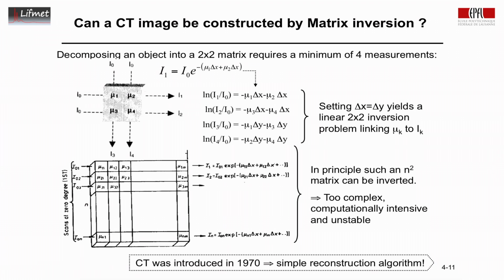On top of this, we have to consider nowadays that computed tomography was introduced in 1970. So we have to be a bit simpler in the mathematical tools that are being used. We need a simple reconstruction algorithm.